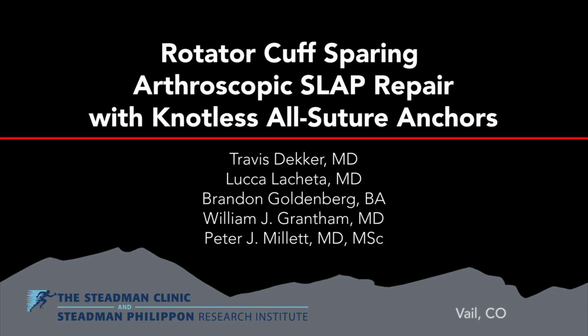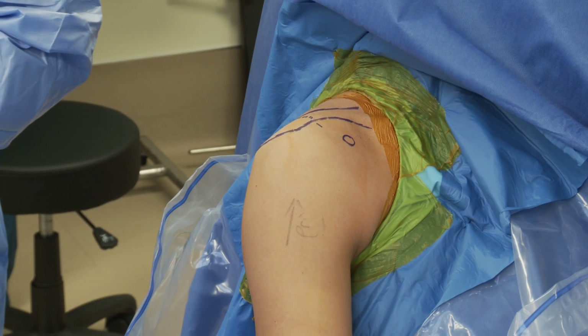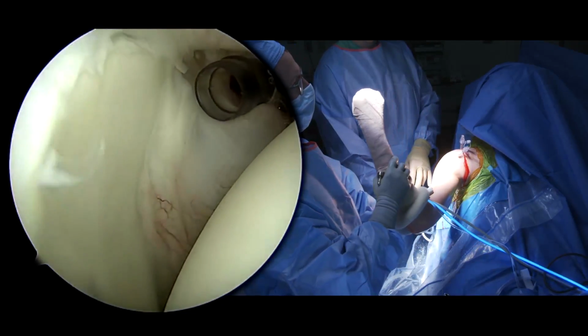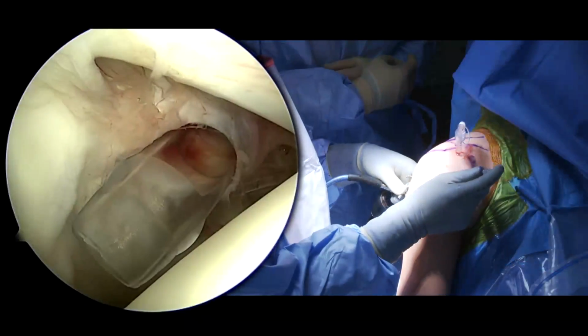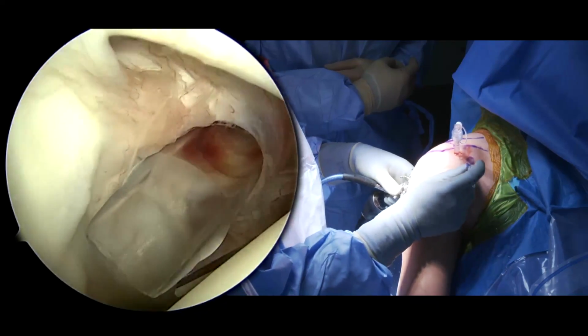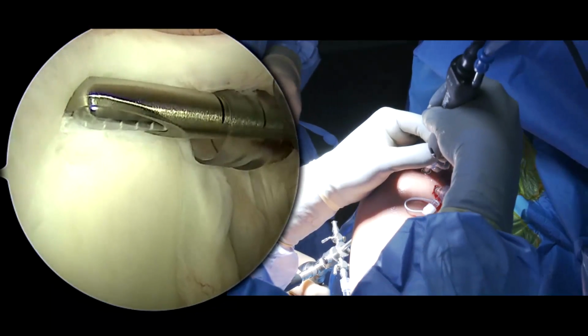This is a presentation of a rotator cuff sparing arthroscopic SLAP repair with knotless all-suture anchors. The case has begun with a dynamic examination under anesthesia with the arthroscope in the posterior viewing portal, evaluating for instability of the biceps root as well as internal impingement. A standard rotator interval portal has already been established, and an auxiliary low anterior working portal is now being established.